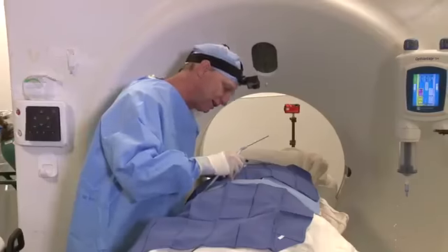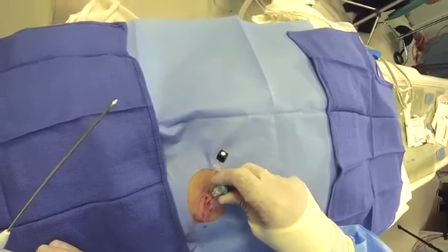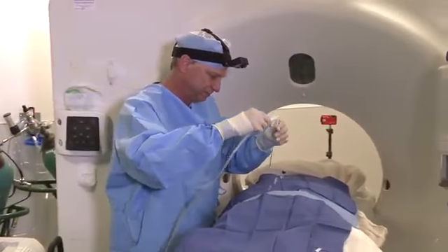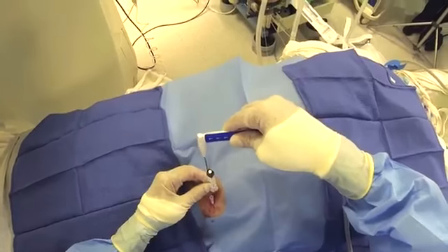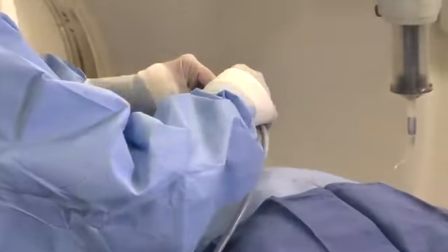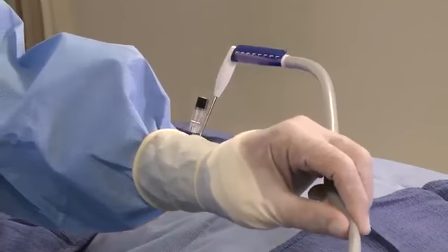So I'm going to make a little nick with an 11 blade, just cephalic to the marker needle that I have in place. And that's just enough to let the probe in. I want to parallel the guide needle as best I can. And again, I'm not going to commit the full depth. We're going to take a look and adjust. These needles, or these probes, I should say, are stiff and very, very maneuverable.